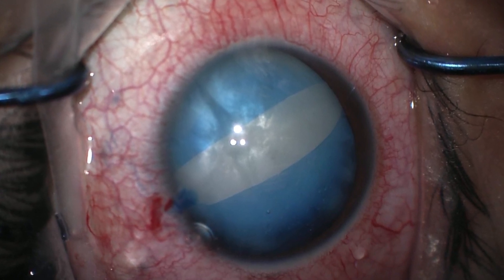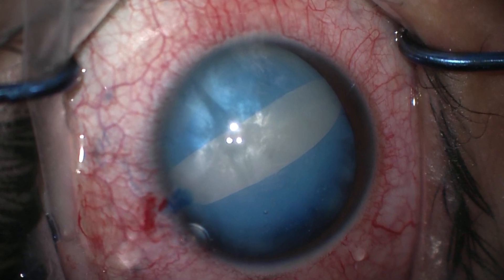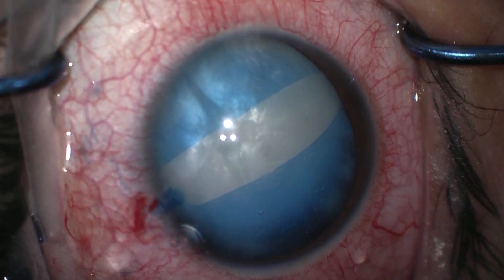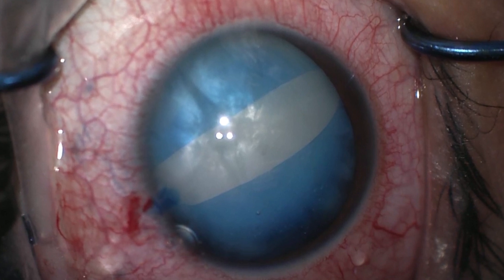During capsulotomy, when the intralenticular pressure dissipates into the chamber, the differences in pressure between the anterior and posterior capsule causes the lens to be pushed forward. This places strain on the capsule which can cause a biradial capsular tear.